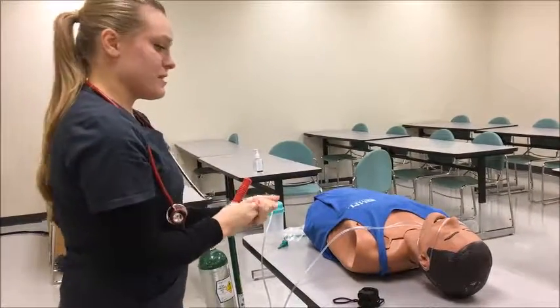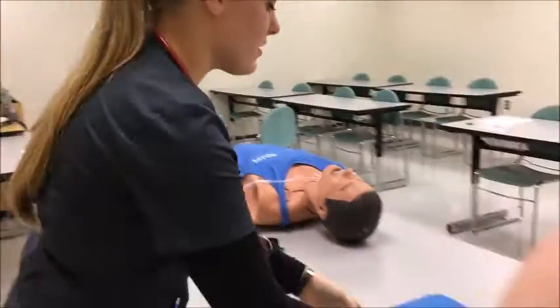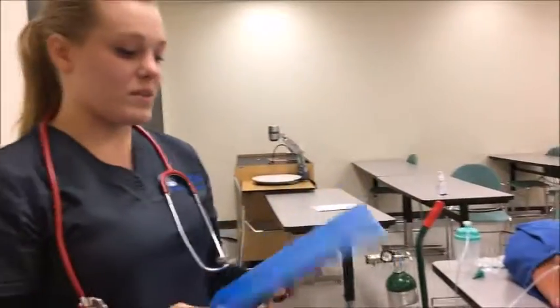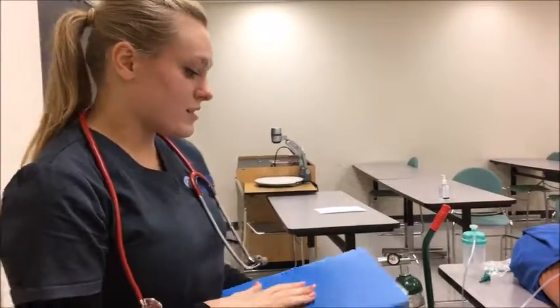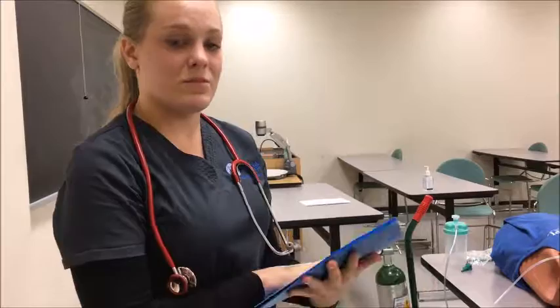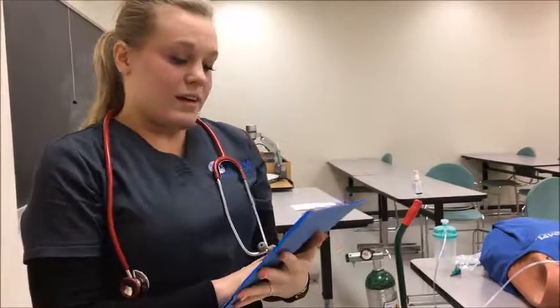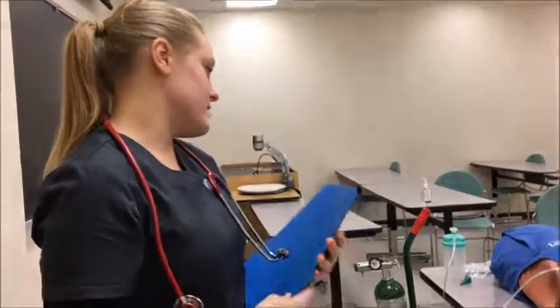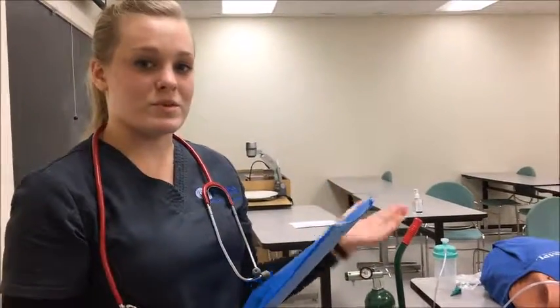Okay, patient is comfortable. I left him there. And now I'm out of the room. I'm recording the data that I used, what oxygen flow I set him at, the equipment I used, and his sats before and after. And the physician is happy with all the progress, so he's leaving it at the 6 liters a minute and the 44%. So that's it.